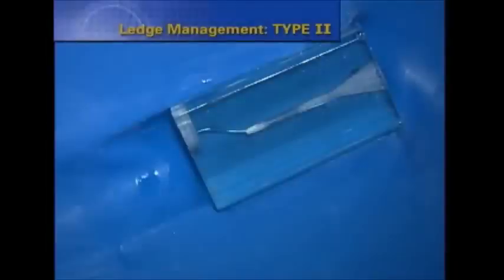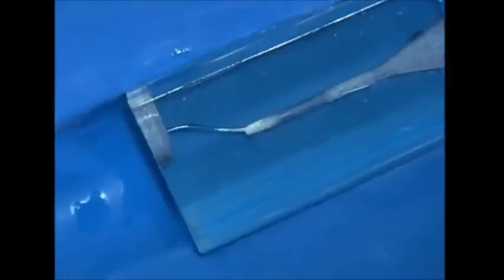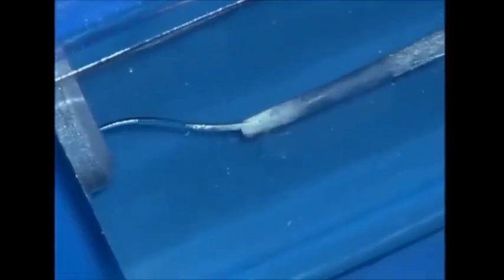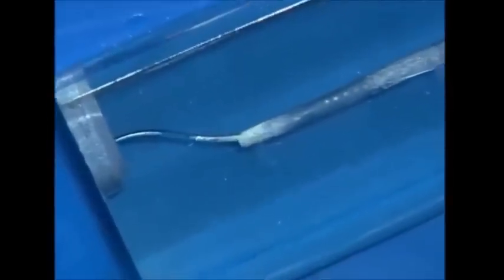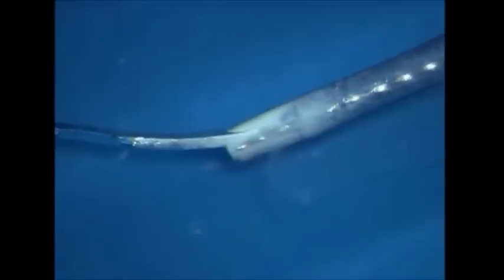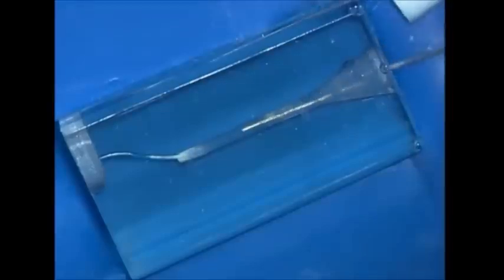Let's look at how to manage a Type 2 ledge. Again, we have the block with the S-curved canal. Notice that there's more debris in this block than there was in the previous case we just managed. Notice the ledge is probably 50% at least larger than in the previous example. Ledge management is always performed in a fluid-filled canal.